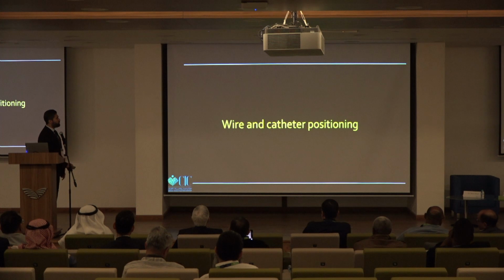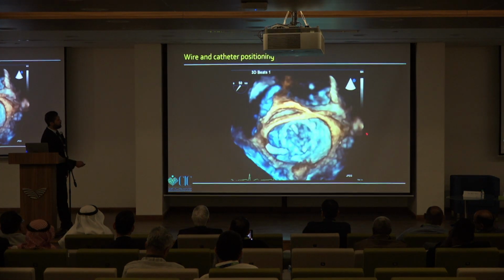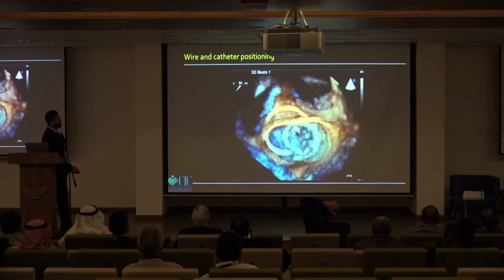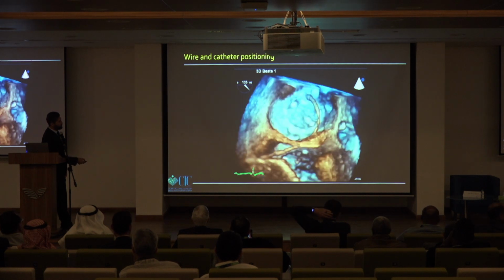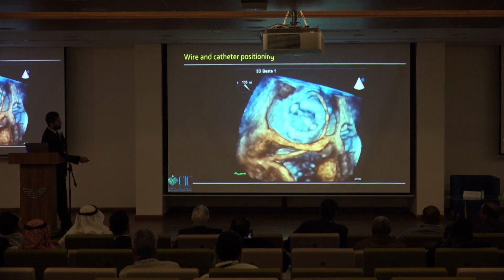Wire and catheter positioning. This is through transeptal approach coming from the IVC, puncturing the septum all the way to the defect. This is another view, starting from something like a bicaval view, superior vena cava, inferior vena cava.